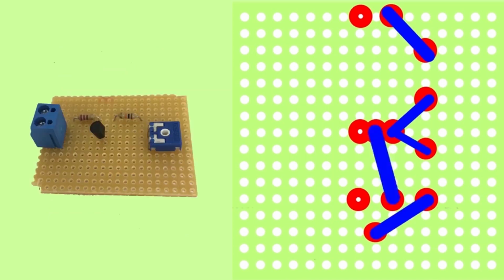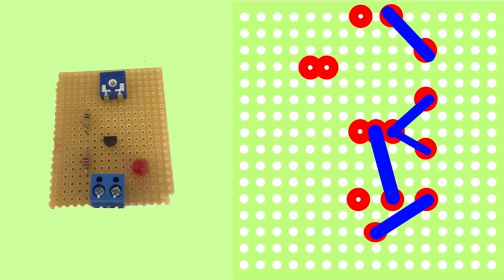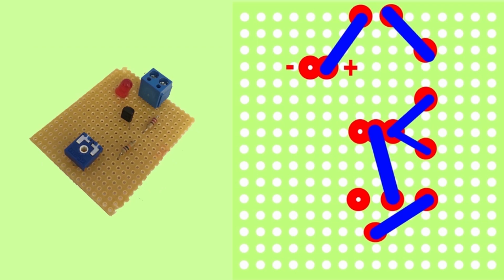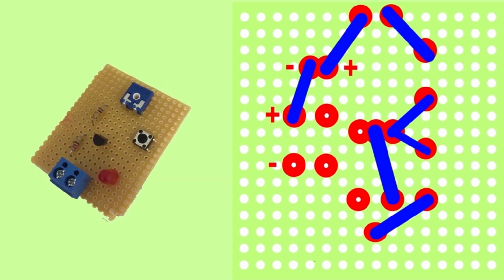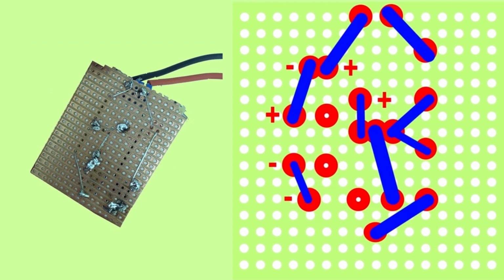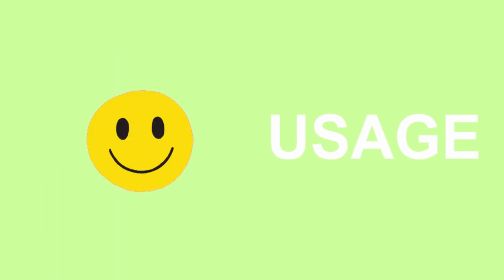Now the other side of the 33 ohm resistor will be connected to the trimmer, as well as the transistor will be connected to it. The negative part of the battery will be connected to the switch, while the positive part of the battery will be connected to the output. Now the negative part of the switch will be connected to the negative part of the power supply and the positive to the transistor. Now let's look at the usage of all of this.